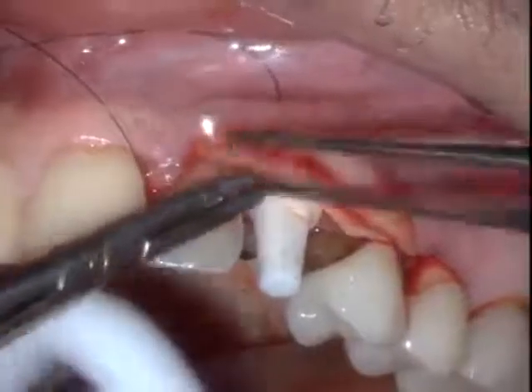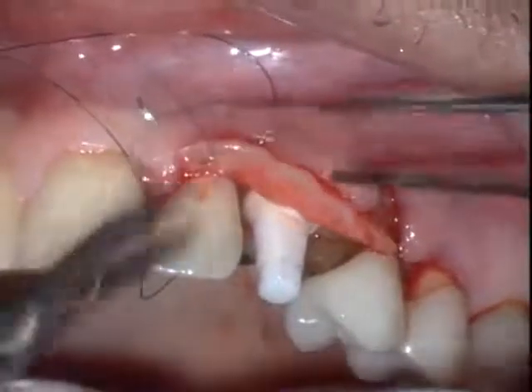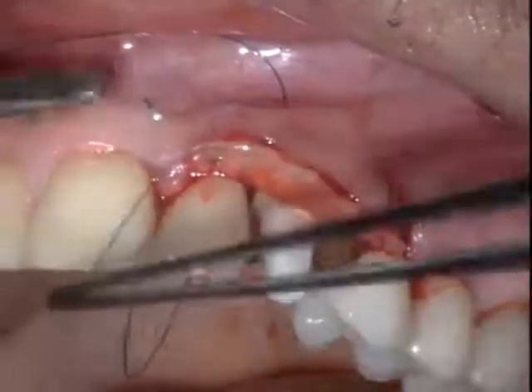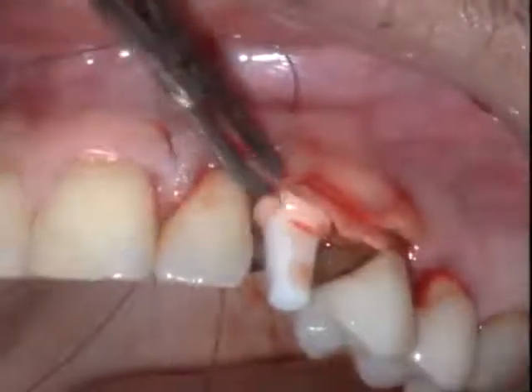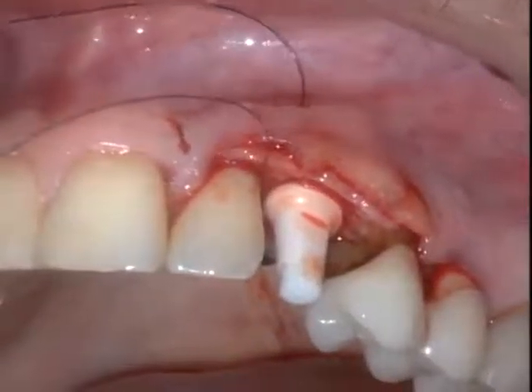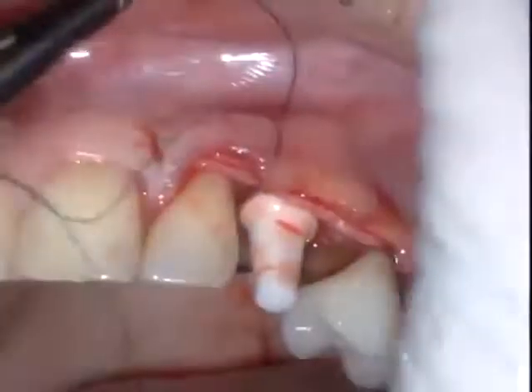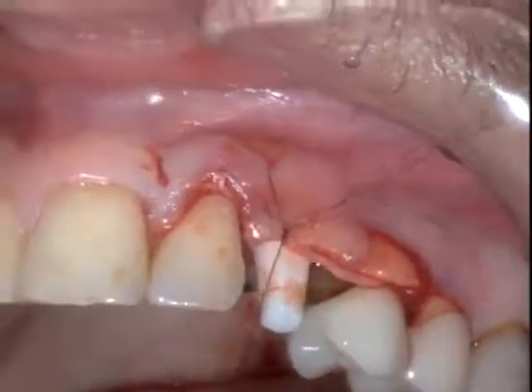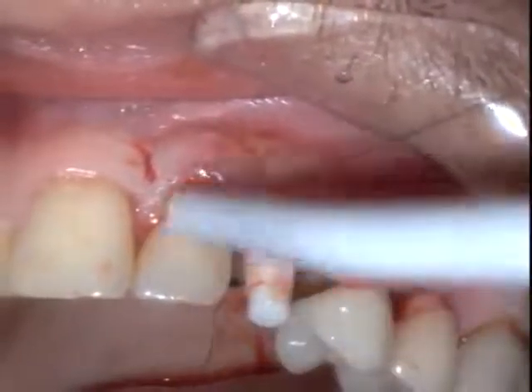The zirconium implant is going to be used in a method to help us anchor our graft just underneath the buccal margin. So it will assist us during the suturing to locate the graft ideally for the future preparation of the implant and the final aesthetic margin.